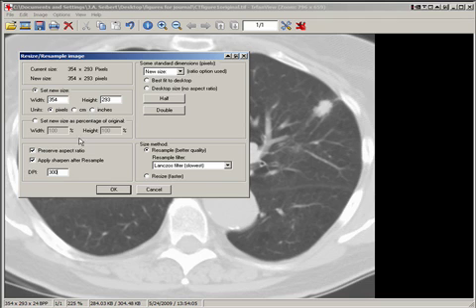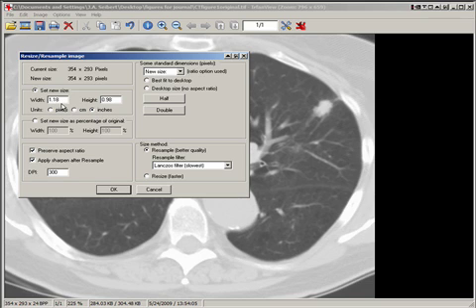The next issue is moving up two boxes and setting the actual size in inches. Checking the inches box, we see that the current width and height is 1.18 inches and 0.98 inches, respectively.